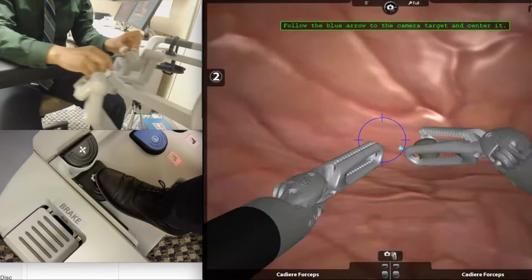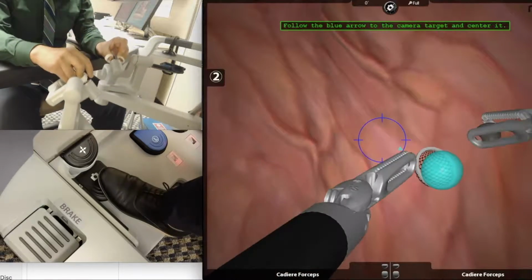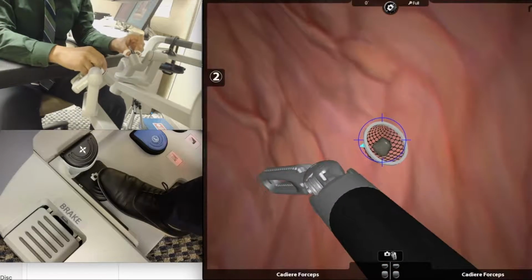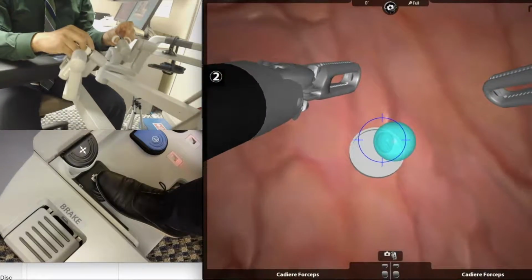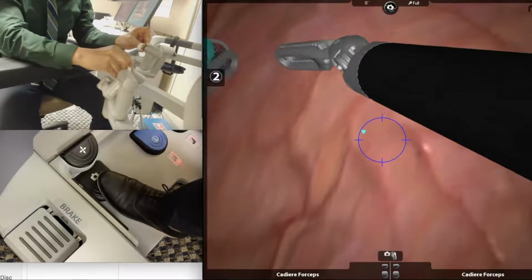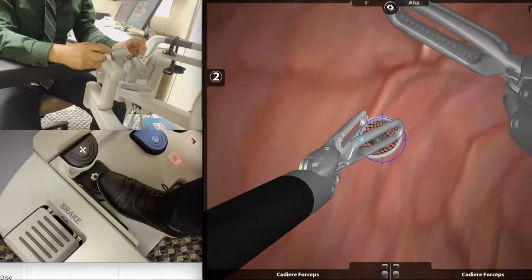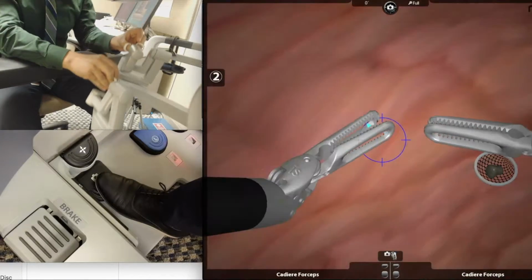Notice the swinging action of my arms in coordination with the foot pedal to move to the next target. A tiny arrow in the crosshairs directs me to the location of the next target. It is common in this exercise to be off horizon as there are no vertical or horizontal axes. To avoid this, the camera at the 12 o'clock position should serve as a guide.